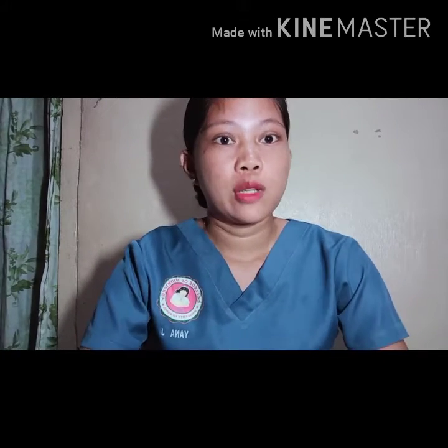First, you will review the physician's order. A physician's order is necessary to initiate IV therapy. The physician's order should include the type of solution to be infused, route of administration, exact amount or dose of any medications to be added to a compatible solution, either hourly or 24-hour volume, rate of infusion, duration of infusion or the time over which the infusion is to be completed, and the physician's signature. So that would be the things included in the physician's order.